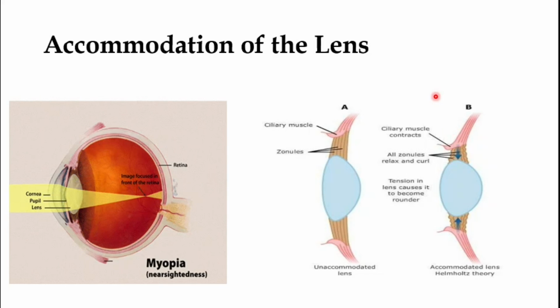So, for example, any drug, whether it stimulates or inhibits the parasympathetic nervous system, will affect the accommodation of the lens. For example, you know the drug pilocarpine. Pilocarpine is a parasympathomimetic drug. It stimulates the parasympathetic nervous system, and that stimulation contracts the ciliary muscles, which makes the lens convex, and the person focuses for near vision.